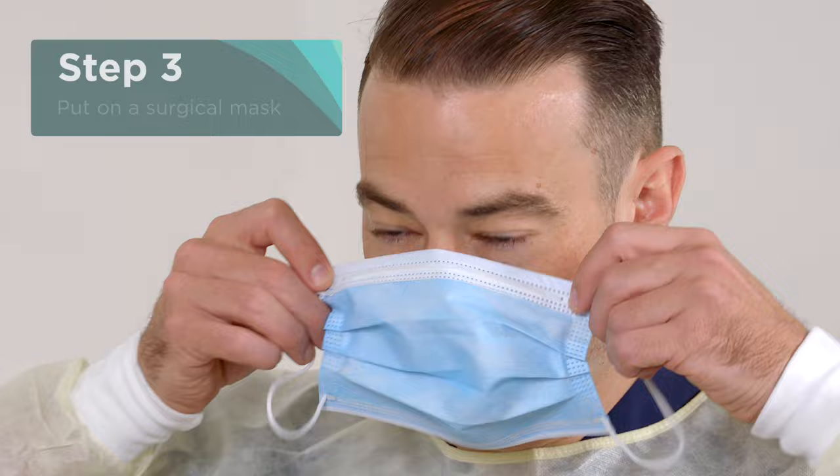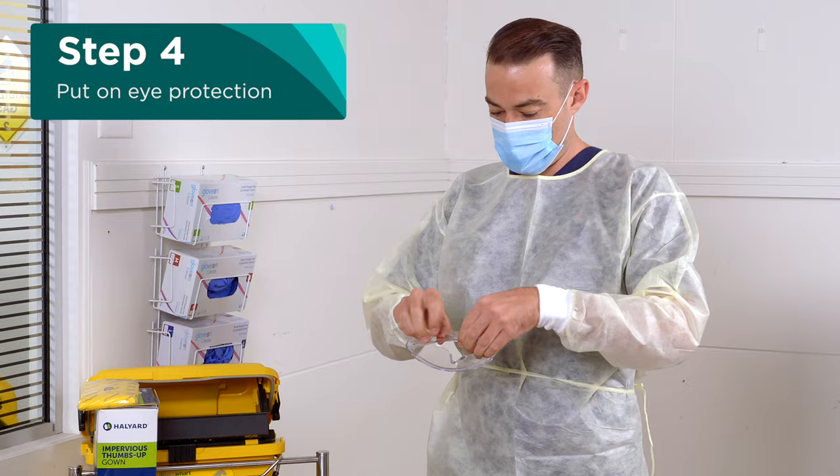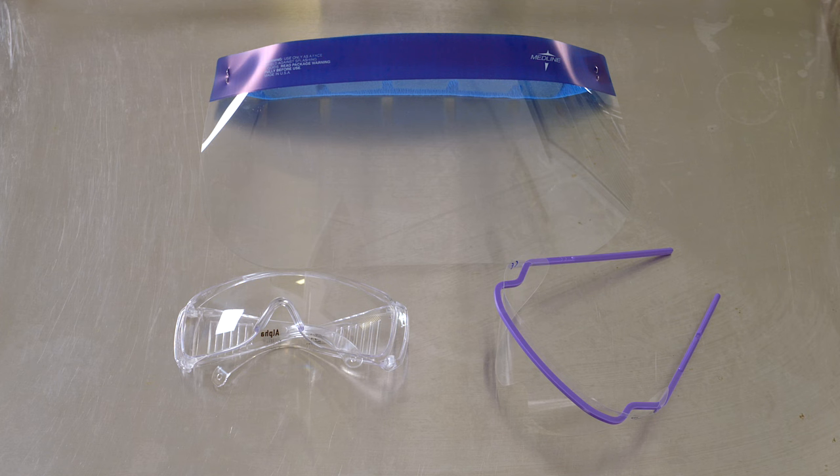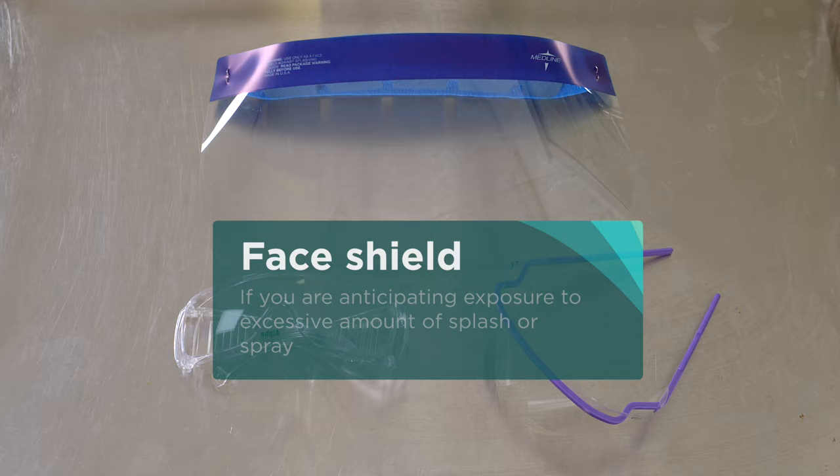The next step is to put on a surgical mask to cover your nose and mouth. Then put on your eye protection, either safety glasses or an eye shield, or a mask visor or a face shield if you are anticipating exposure to an excessive amount of splash or spray.